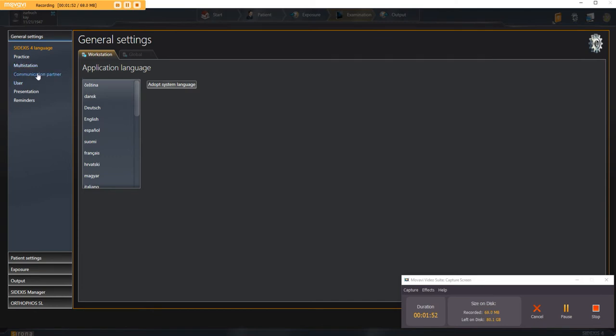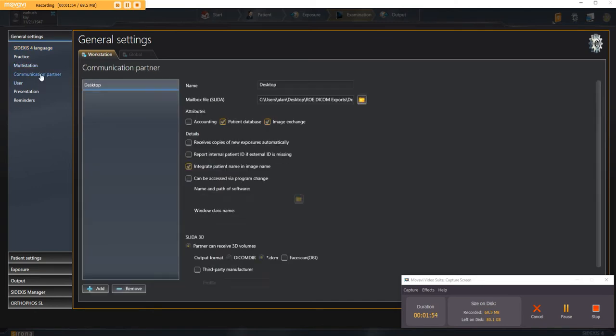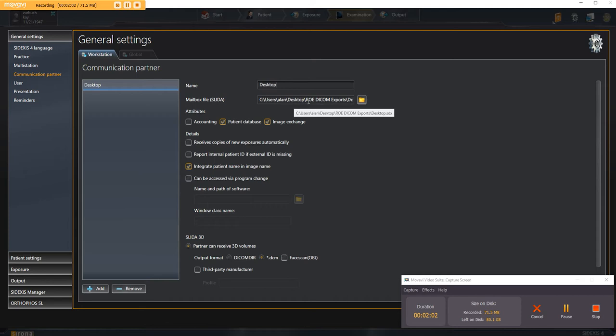You'll go to communication partner, here highlighted in blue, click it. What you'll do is name it - I named it desktop - but you can name it whatever you'd like. And then where are you gonna save it?